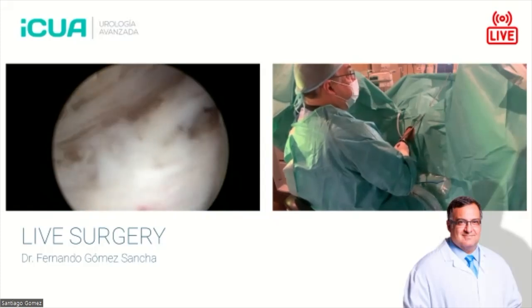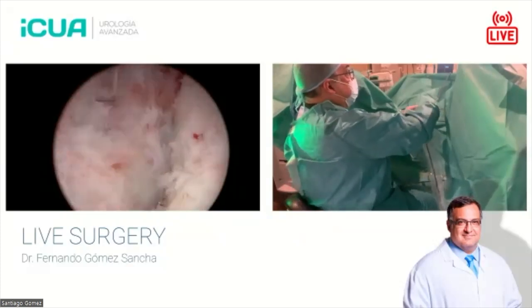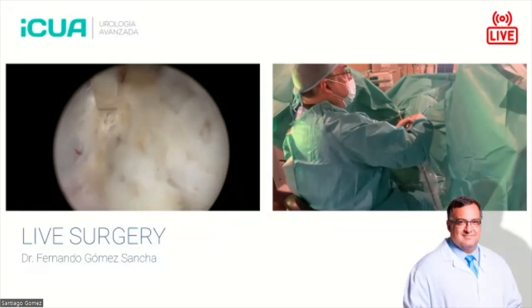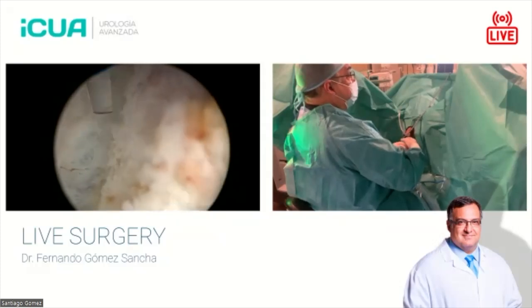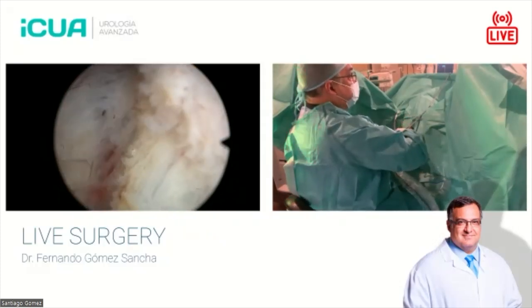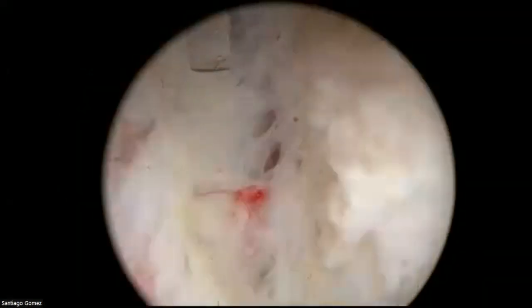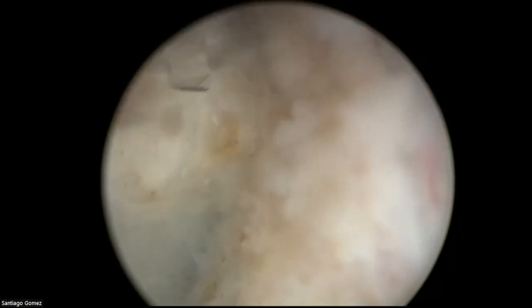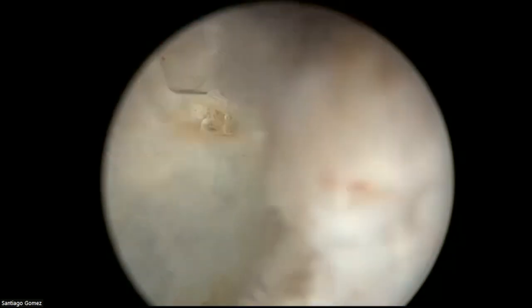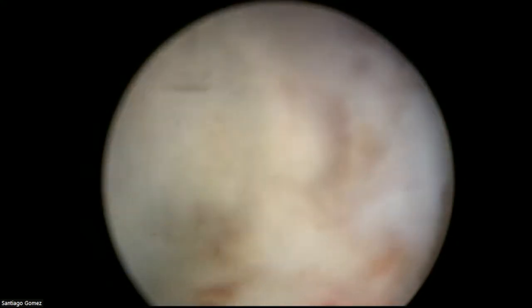Here you see also one of the details I like: my fiber is very static. One of the problems with understanding the anatomy of HoLEP is that sometimes surgeons move around the camera and the fiber. They have the theory that if you are at this position in this part of the prostate, maybe the angle of incidence is better to do the dissection. But to me, this is like an Olympic shooter. The Olympic shooter fires with the gun at 12 o'clock. He doesn't fire like the New York gangs that fire with the pistol sideways, you know what I mean?